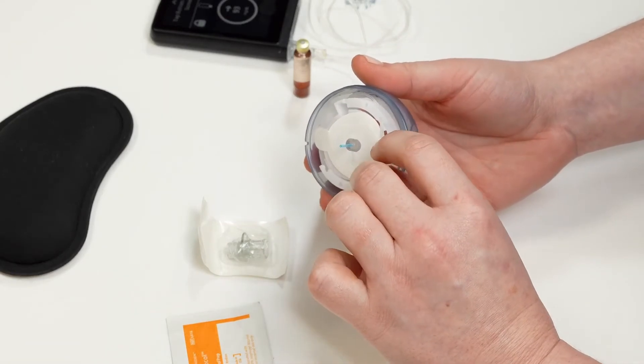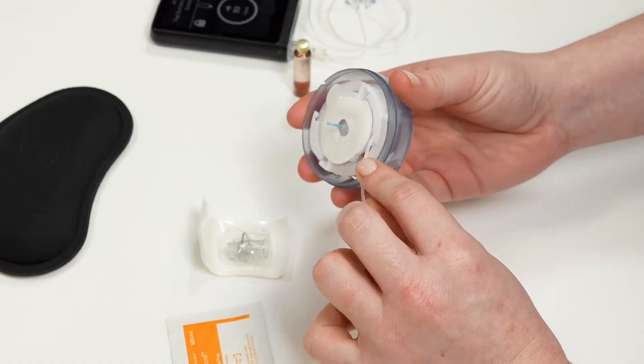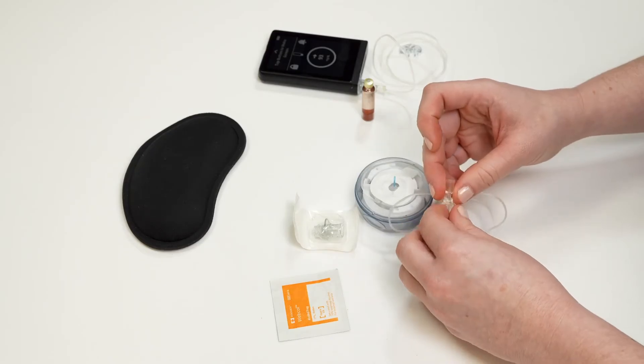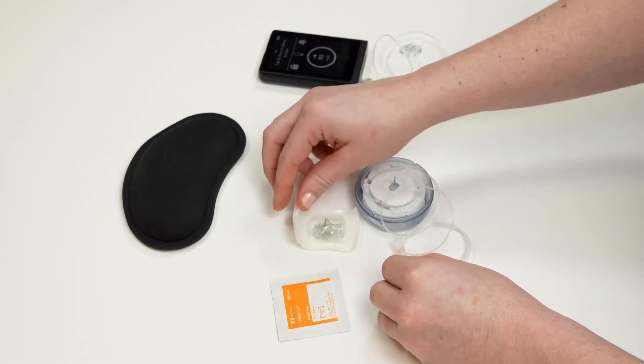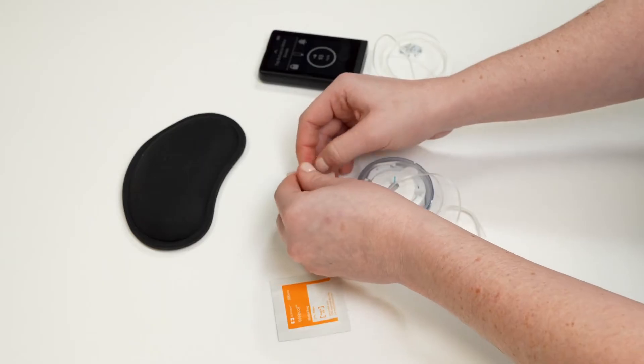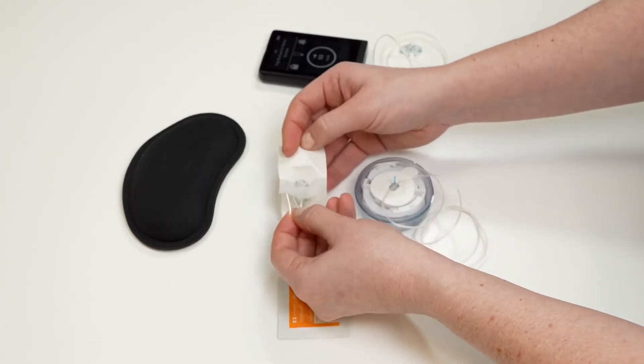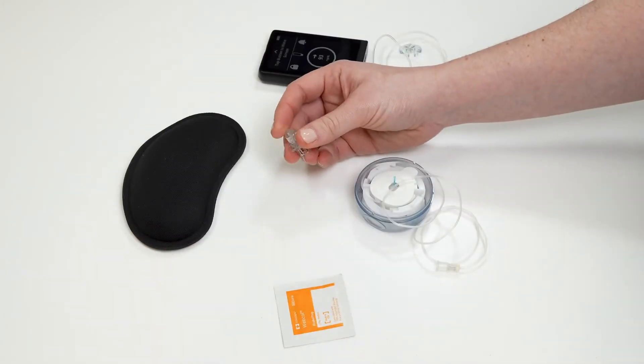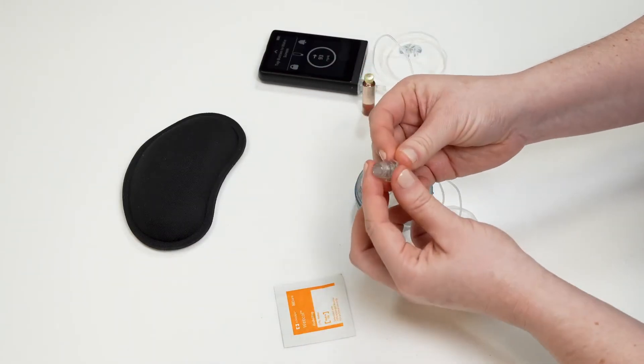Gently unhook the tubing and slowly unwrap it from the inserter. Locate the lure lock connector at the end of the tubing. Open your islet connect package and connect the islet connect and the end of your tubing together by twisting one onto the other.